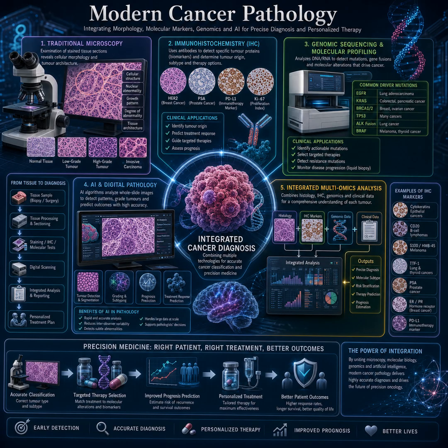Today, diagnosing cancer is no longer about looking through a microscope alone. It is about integrating morphology, immunohistochemistry, molecular biology, genomics, and artificial intelligence to deliver truly personalized medicine. The journey still begins with traditional microscopy, the foundation of pathology for more than a century.